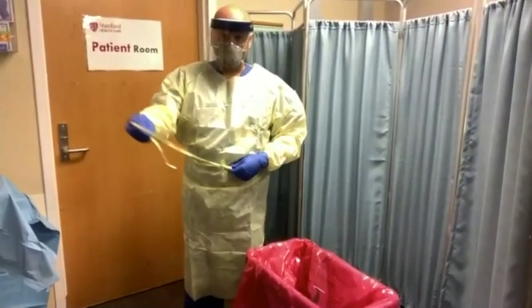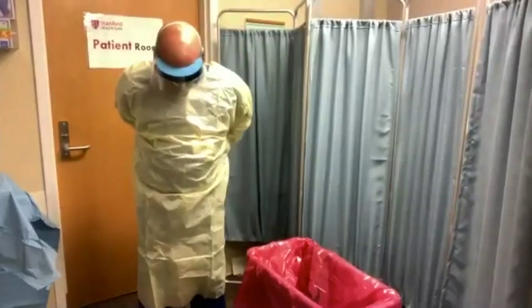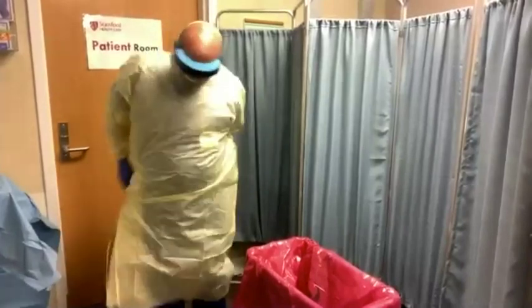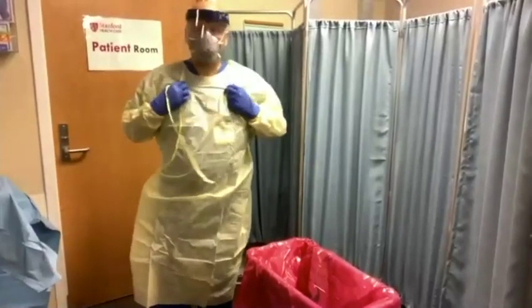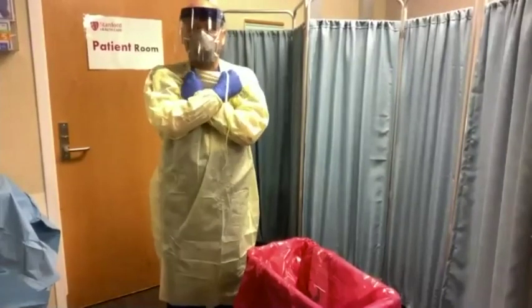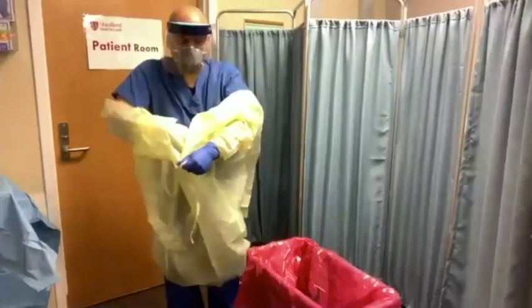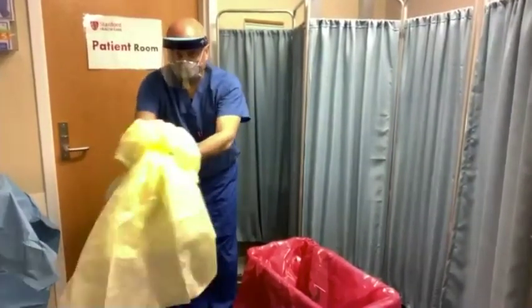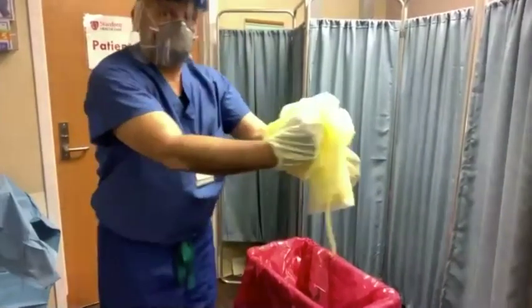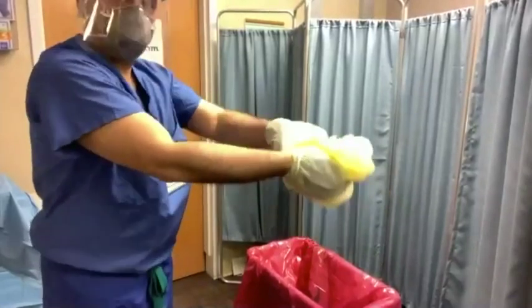Once the gel is dry, untie the straps and hold them in your hands so that they don't dangle down and contaminate your scrubs. Lean forward, cross your hands, reach towards your shoulders and pull off the gown. Make sure not to let the gown touch your clothes. Remove the gown inside out so that you're only touching the inside. Roll it into a ball and dispose of it into the biohazard bin.